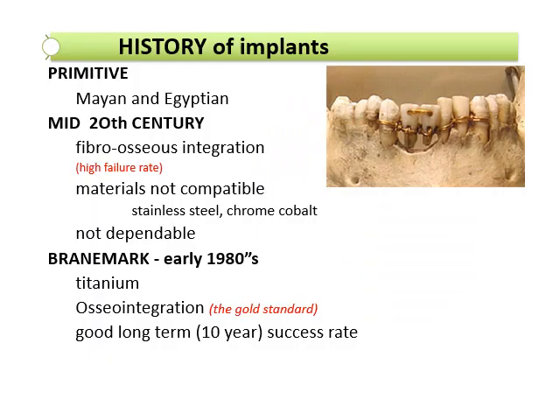Okay, so let's talk a little bit about the history of implants. Under week 13 in BB-Learn, you'll find an article that I've attached. It's kind of a fun perspective of dental implants, so just go over there and check that out after the lecture. It really goes into more detail, but I'll give you a brief overview. But that picture in the upper right hand corner, that's a real picture, and we're going to talk a little bit about that in a second.